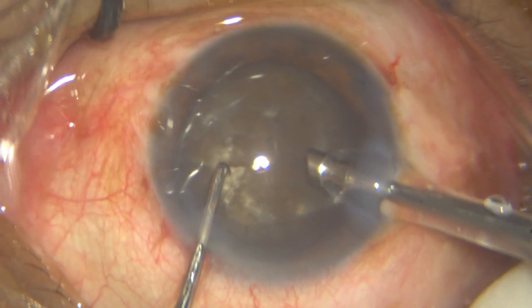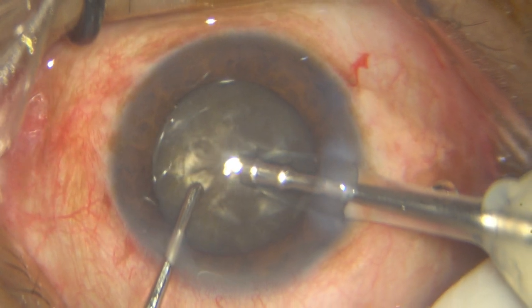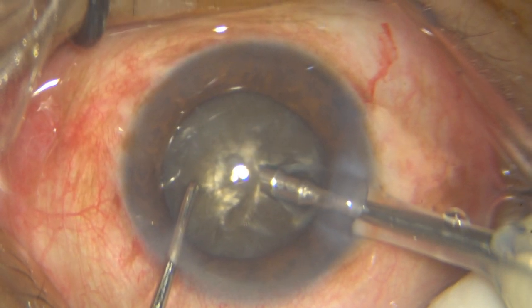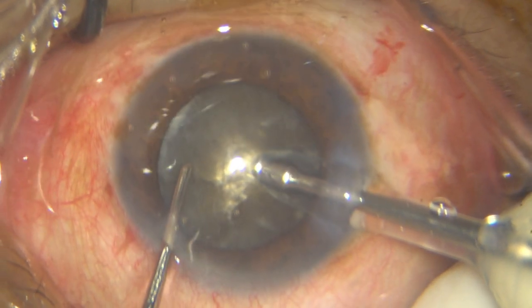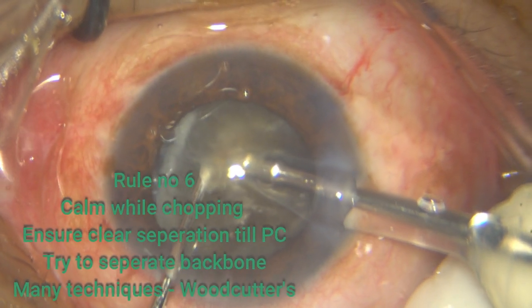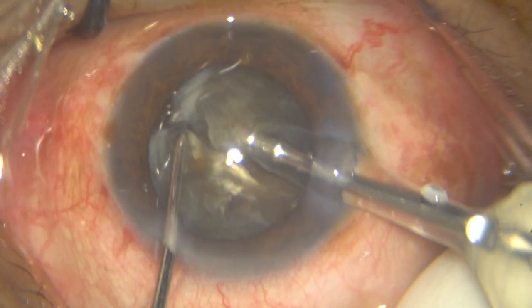Now when you start your phaco, I'm doing the woodcutter's chopping technique. I've taken my sharp chopper. Make sure you take out the superficial cortex. I'm making a small trench there to get an adequate depth, and very important to bury both your phaco tip and the chopper deep into the nucleus pulp and go towards each other, laterally separate. Watch, look for that red reflex clearly.